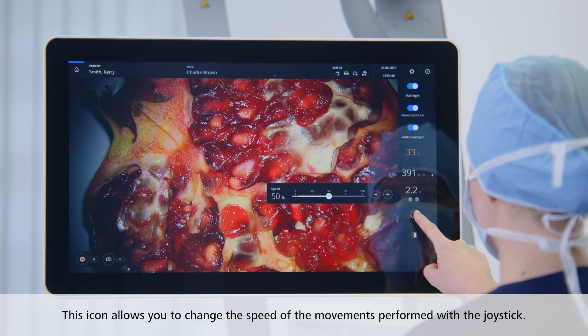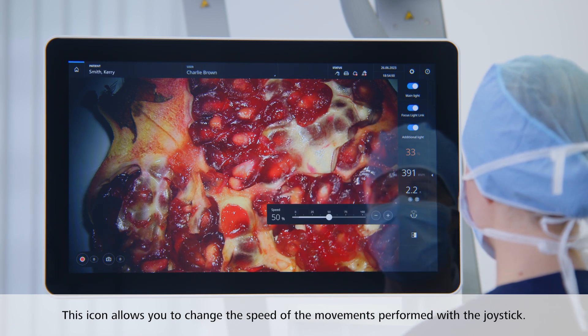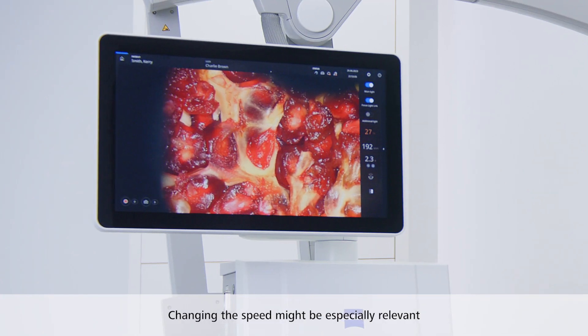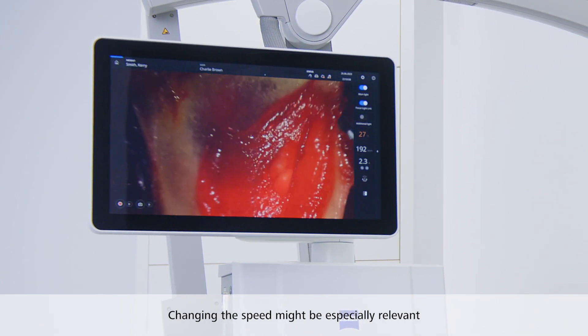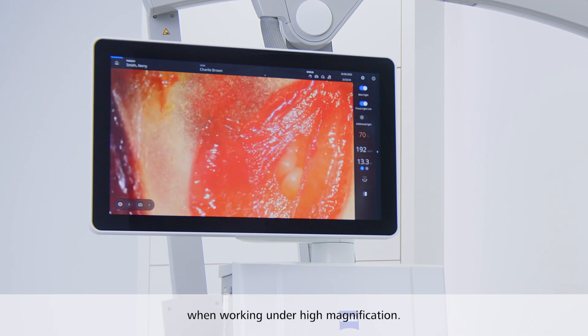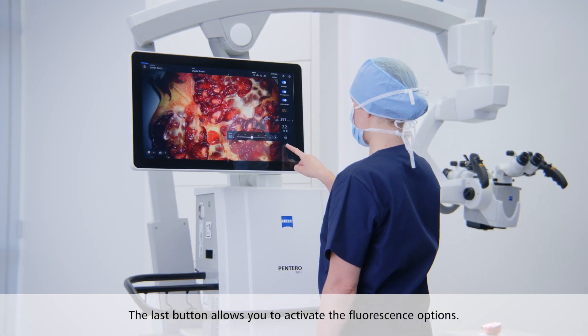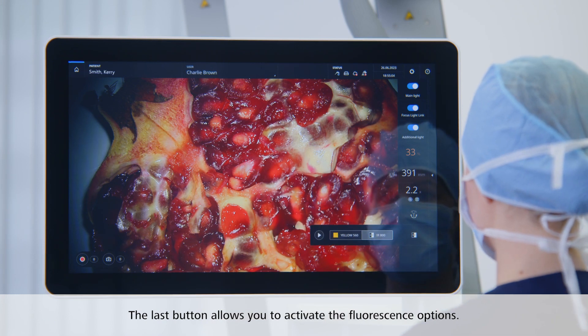This icon allows you to change the speed of the movements performed with the joystick. Changing the focus, zoom, and movement speed might be especially relevant when working under high magnification. The last button of the control center allows you to activate one of the fluorescence options.